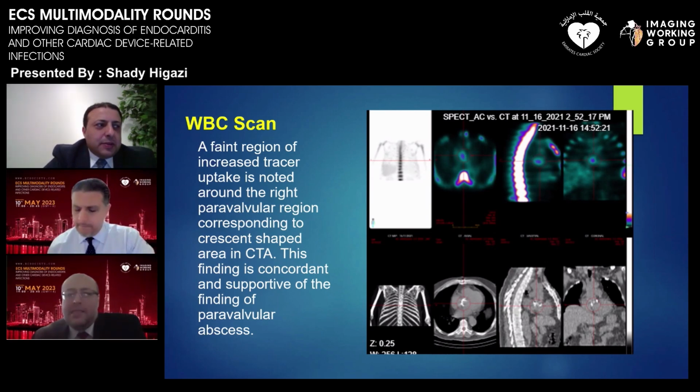But as you can see, on the CT it's a catastrophe. You can see here it's minor uptake. So you can see the sensitivity issue with your eyes. You saw how bad the abscess was on the CT, and here somebody can argue this is just mild uptake. So there is clearly a sensitivity issue here. On the CT, this was somebody who needs intervention.